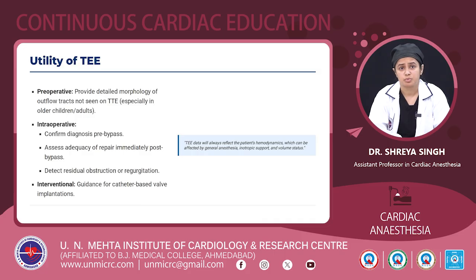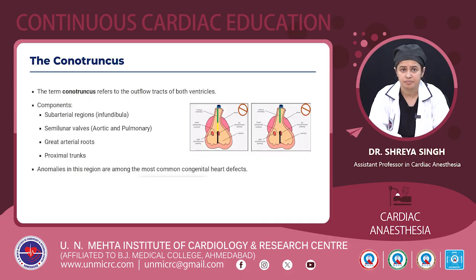So in the preoperative period, it provides us with detailed morphology of the outflow tracts, which are not seen on transthoracic echocardiography, especially in older children or adults. In the intraoperative period, it helps us to confirm the diagnosis in the pre-bypass period. It assesses for the adequacy of repair immediately post-bypass, and it also detects any residual obstruction or regurgitation. And in interventional procedures, it can guide us for catheter-based valve implantations.